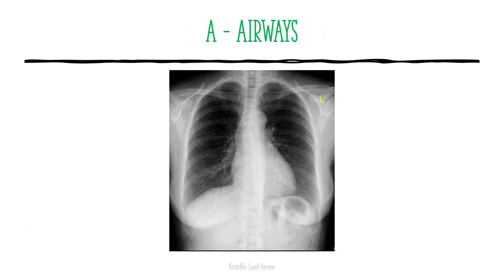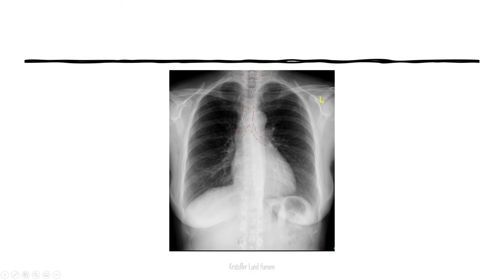Then we start with the main assessment. First, we start with A for airways. This is quite a quick step — you look at the trachea and the main bronchi and how they divide up. The trachea should be approximately in the middle of the mediastinum, though it usually goes a little bit towards the right lung.